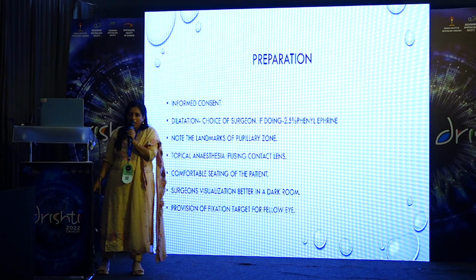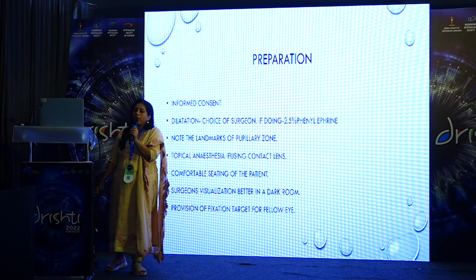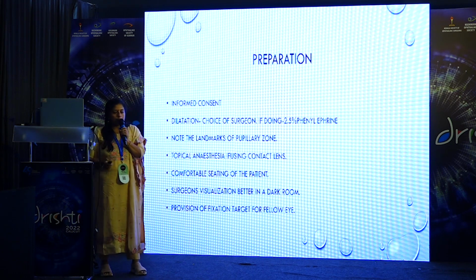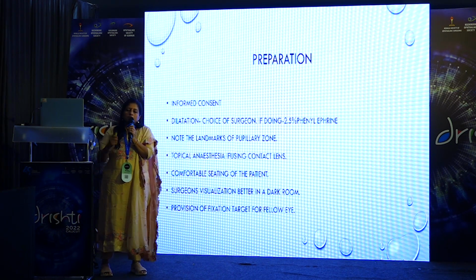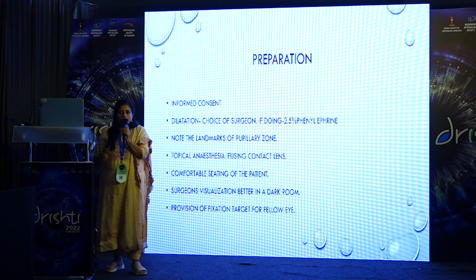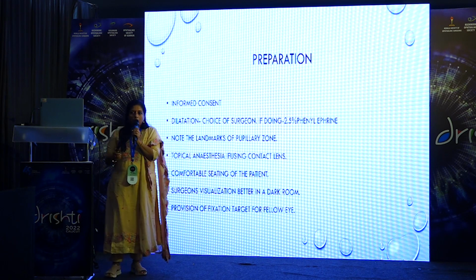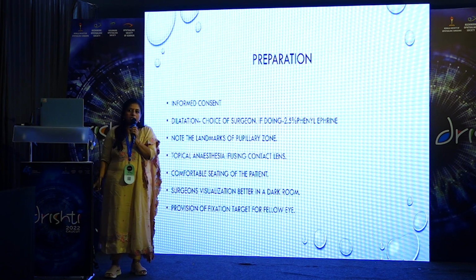Now in the preparation part, you have to discuss in detail to the patient what the procedure is, why we are doing it and what we are expecting at the end of the procedure, and then get an informed consent. The comfortable seating of the patient is very important. It's just like putting the patient on a slit lamp, but you have to explain that they'll hear the sound sometimes and they should not shift the head. Then after proper comfortable seating, the head has to be strapped.